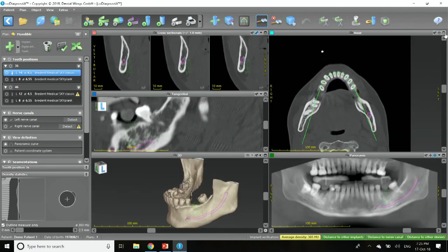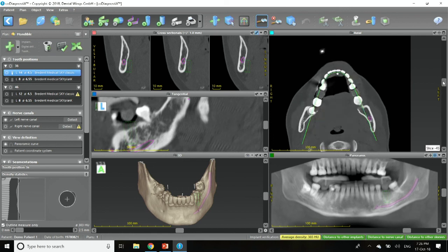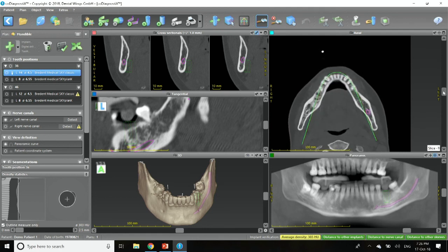It's kind of more difficult than I thought to show you how to read a CT scan. But basically, the views that you need to understand are how the axial view matches with your sagittal view, and to appreciate that when you look up and down, like so, this panoramic curve has to match your arch.